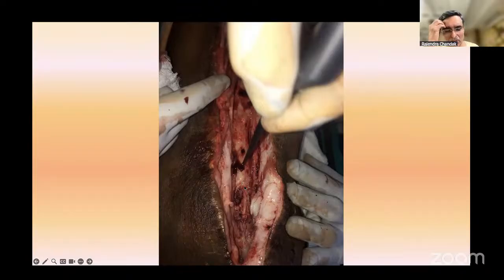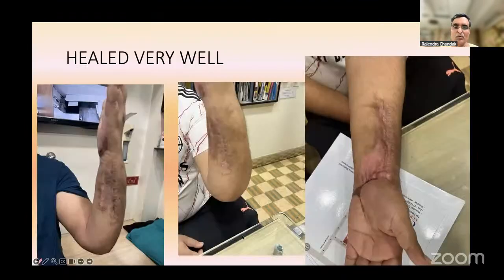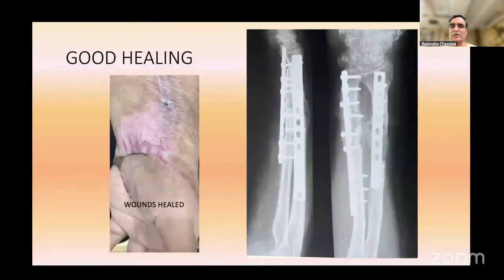And as Rahul said, at times one part of the medullary cavity or the bone can be okay. So the part which is just beneath the plate usually necroses. On the opposite side is viable bone that you can keep intact. And then that patient was managed with a plate again and bone cement. So this is what replating was.